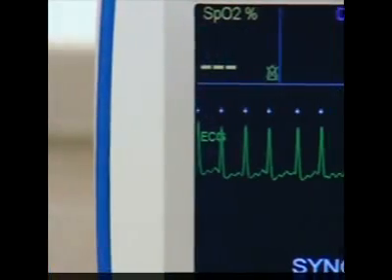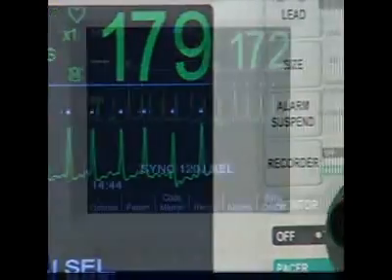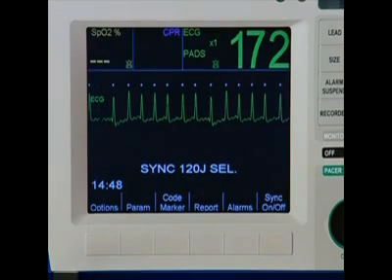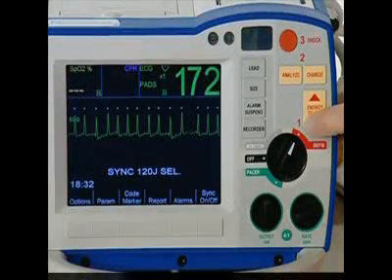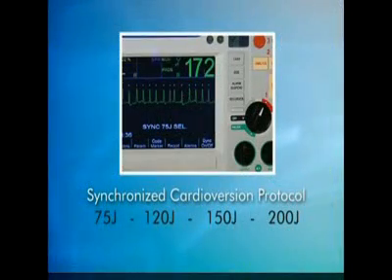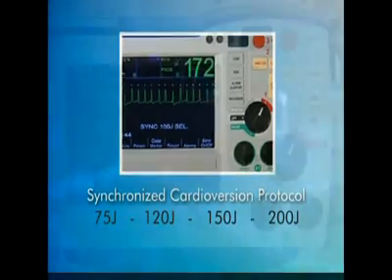Once in sync mode, the device displays down arrow markers above the R wave. These markers indicate points in the cardiac cycle where discharge can occur. Next, select your energy. The recommended starting energy is 75 joules for atrial fibrillation and 50 joules for atrial flutter.